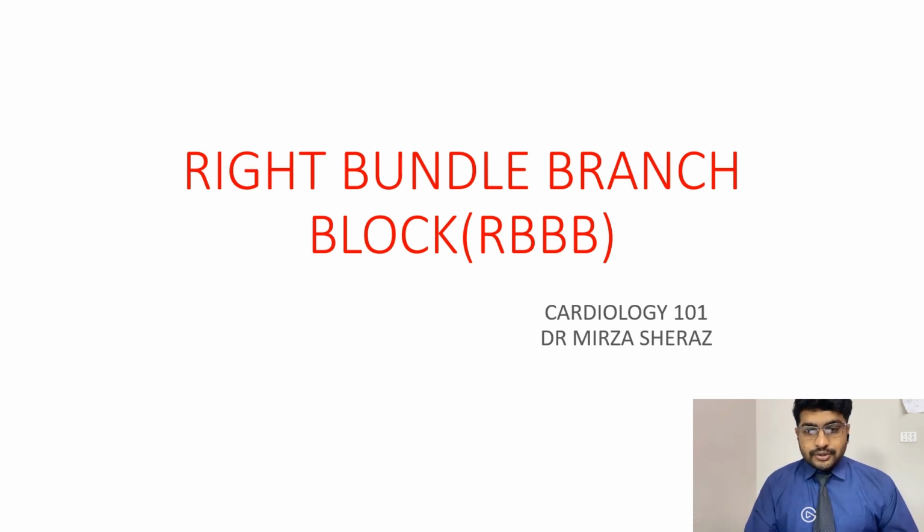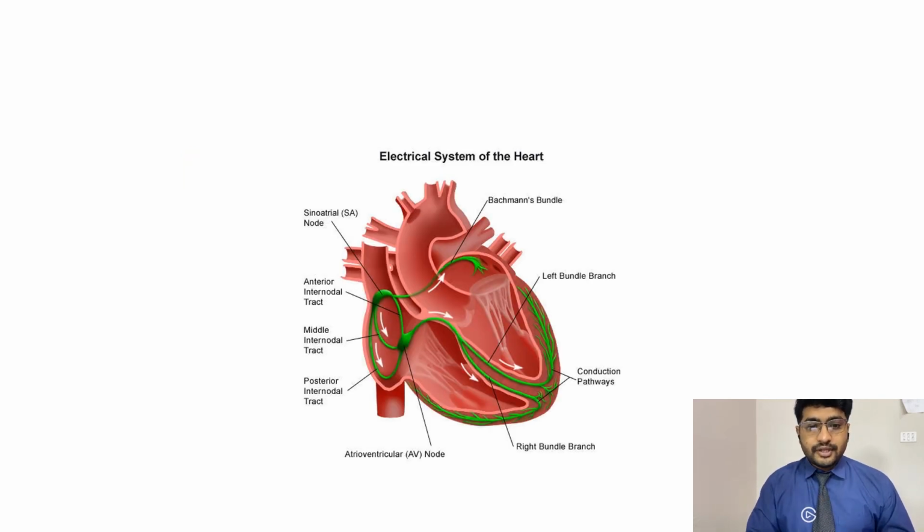With respect to right bundle branch block or left bundle branch block, it is important to note that they accompany myocardial infarctions. So it is very important to point out these bundle branch blocks on ECG and look for the pathological cause of that bundle branch block. All right, so again, we will discuss what is right bundle branch block.